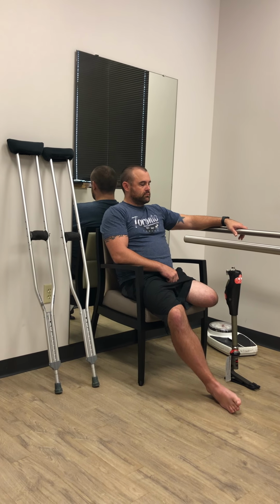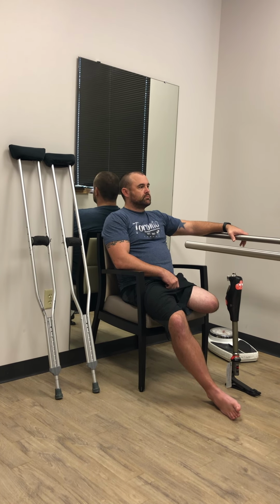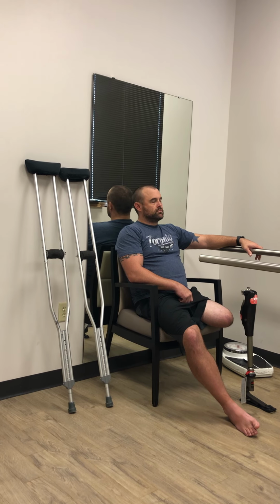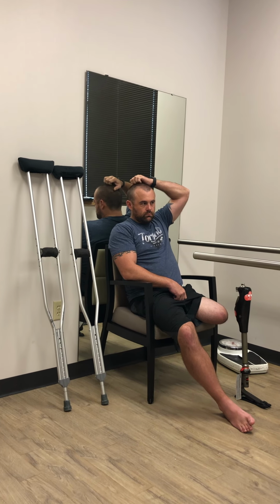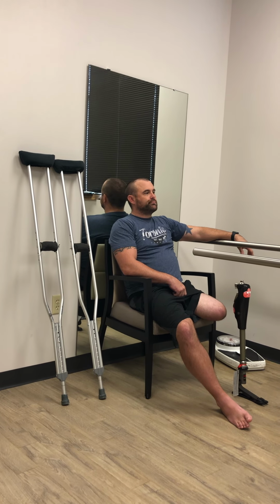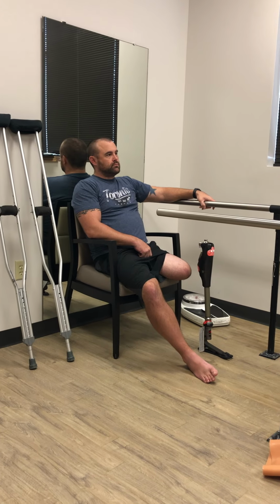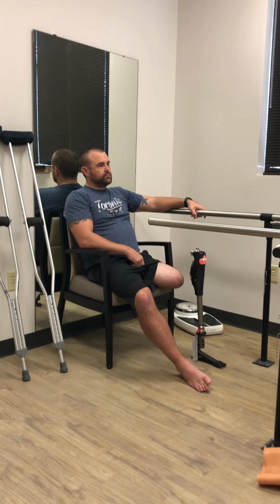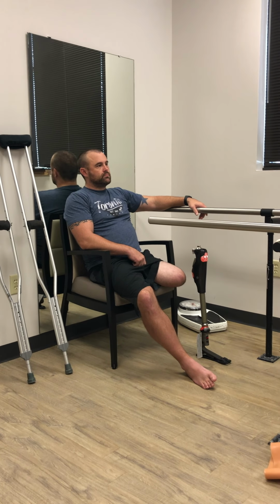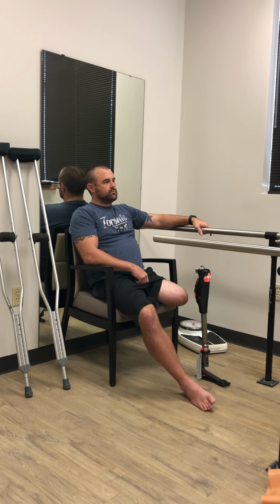For me, after 28 years of doing this, the number one reason for changing a leg out is weight gain and weight loss. I see it all the time. Americans are just more prone to binging, and the holidays give you that. I'll make a brand new leg for someone the first time, get it to them in September, and September, October, everything's great. I'll see you in 6 months.